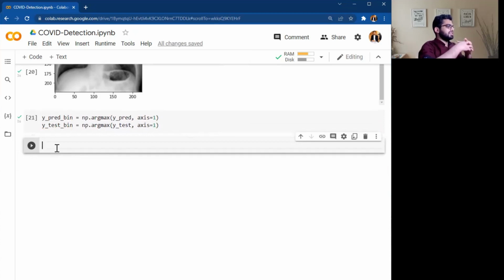The ROC curve is the receiver operating characteristic metric to evaluate our classification model. It typically features the true positive rate on the y-axis and the false positive rate on the x-axis. This means the top left corner of the plot is the ideal place, where the true positive rate is 1 and the false positive rate is 0. I will draw the ROC curve, then you can clearly understand what the ROC curve of our classification model is.